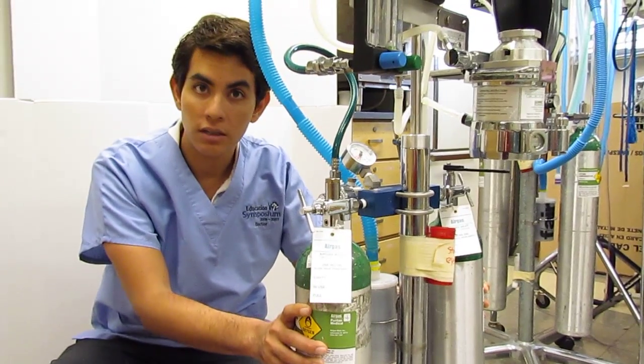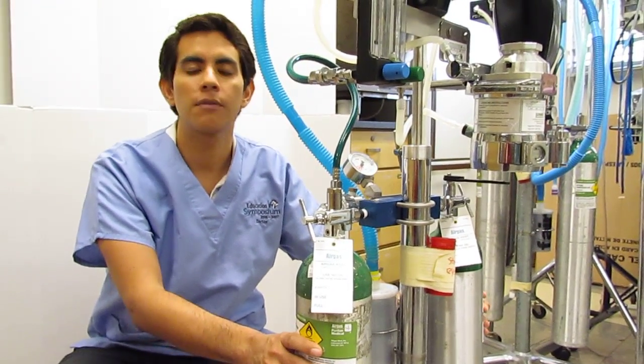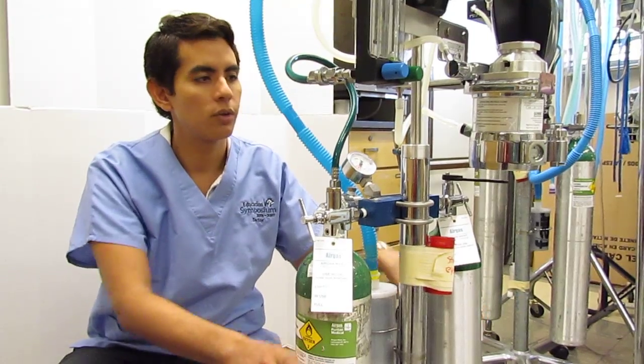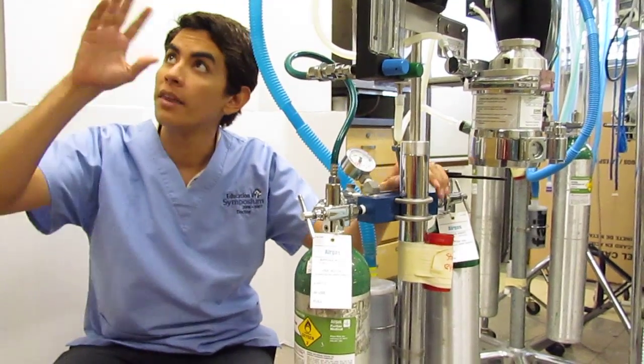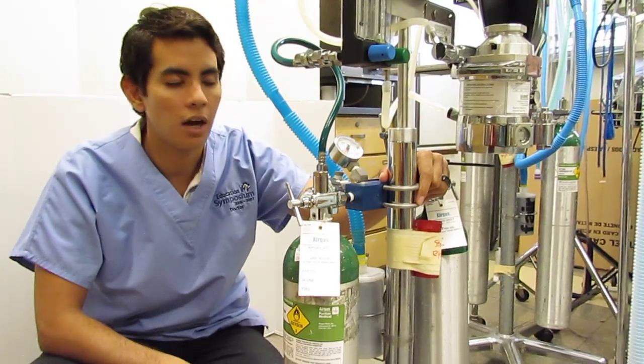Then there's also H tanks, which H is for huge. Those are usually in the back of the building connected to a network of green tubing that then comes down from the ceilings in each of the rooms of the hospital.